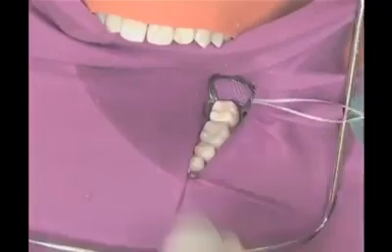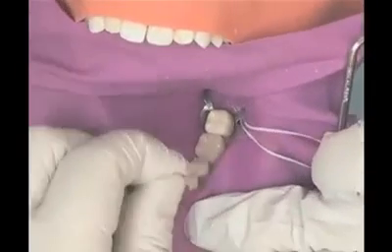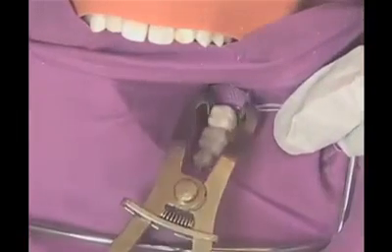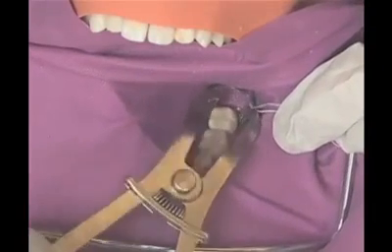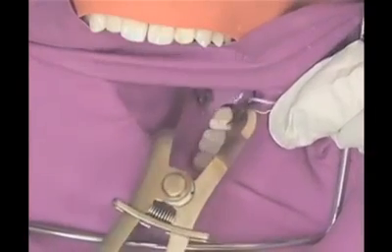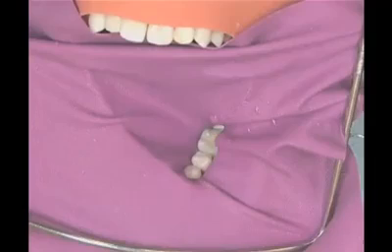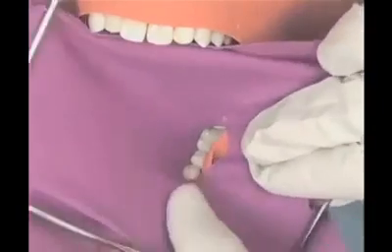Remove any ligatures at this time. Grasp the dental dam forceps and position the beaks into the holes of the clamp and open the clamp by squeezing the handle. Gently remove the clamp from the tooth. Remove both the dam and the frame at one time, making sure to remove any dam material from the interproximal surfaces.